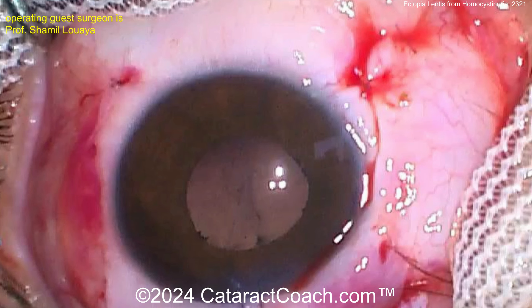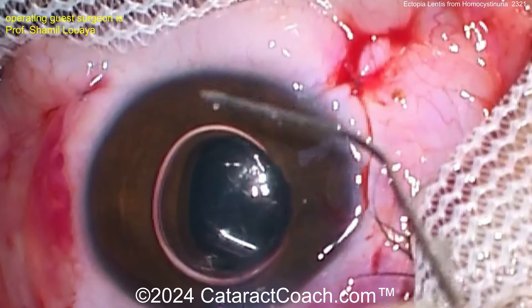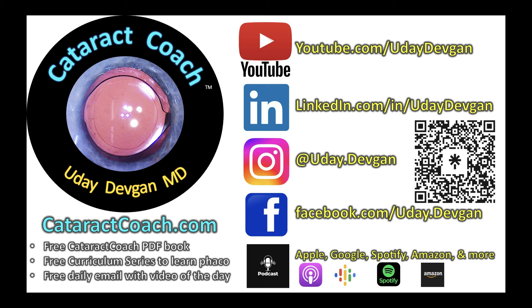Here's the final result with the flanges fully buried — that looks great. A little air bubble is placed in the eye at the end of the case. After surgery: great vision, happy patient, happy surgeon — that is the outcome we like. Remember to check out the podcast every week — a new podcast whose sole purpose is making you a more successful ophthalmologist.